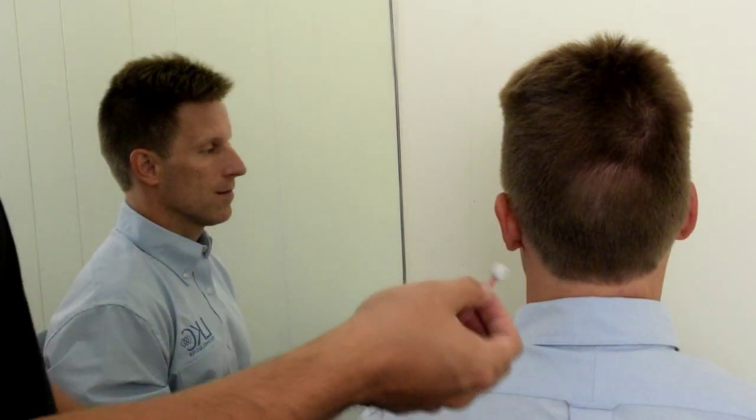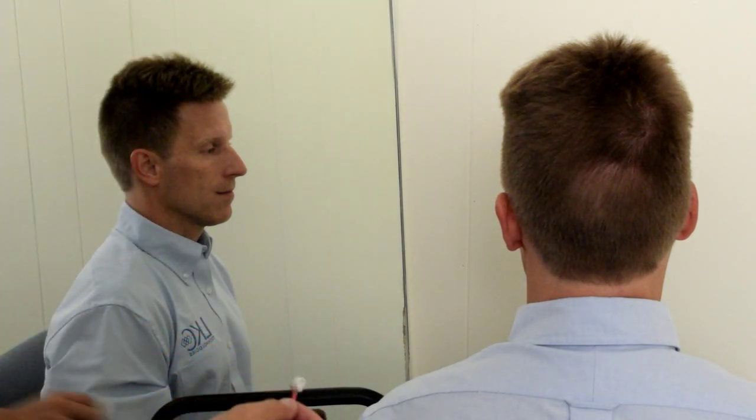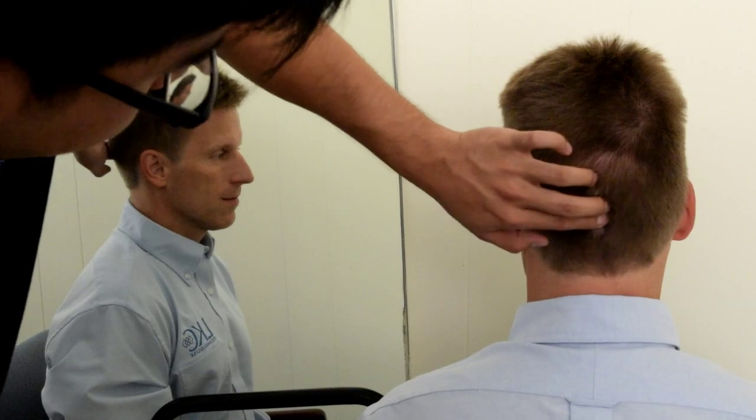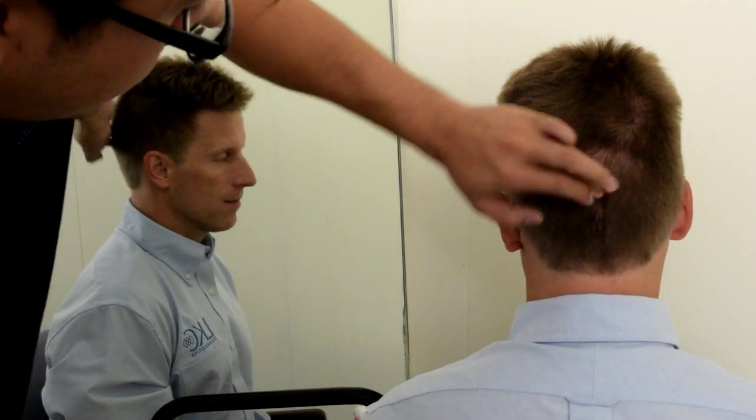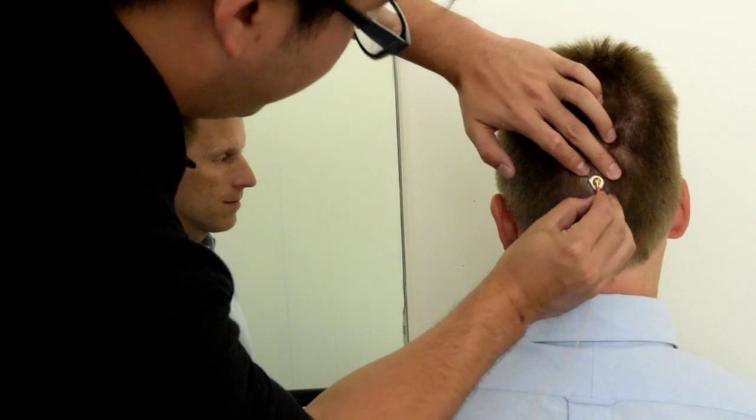Put some paste on the gold cup electrode and place it on the OZ position. Make sure the electrode is secure and connected to the back of the patient's head. You can use tissue and tape to make sure it is sticking properly.